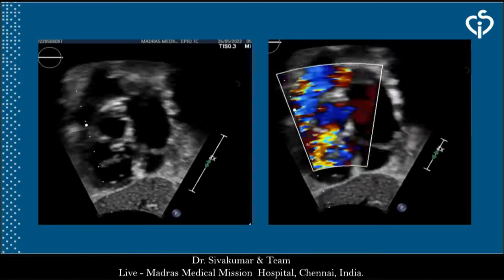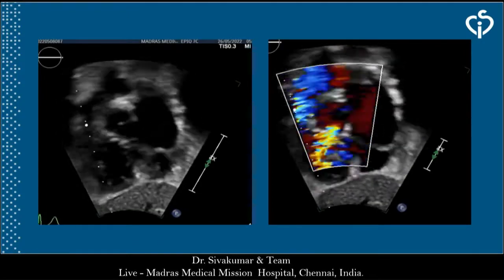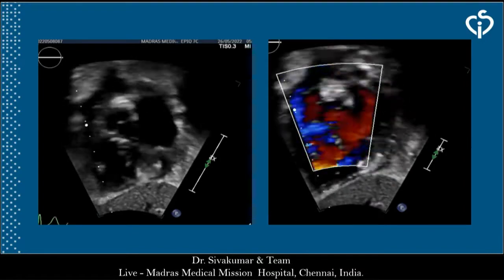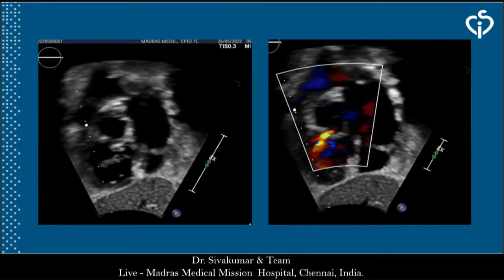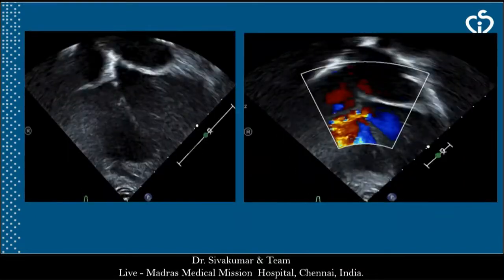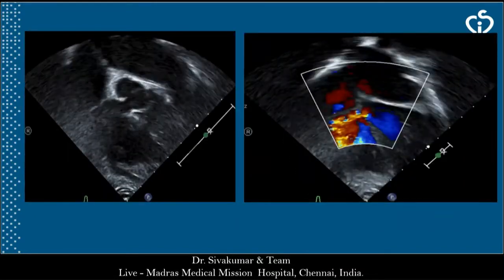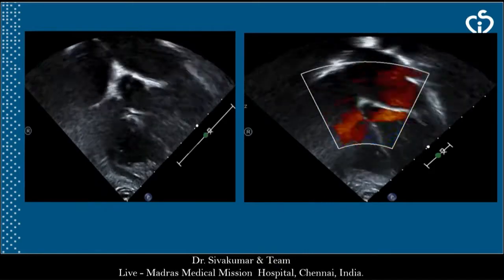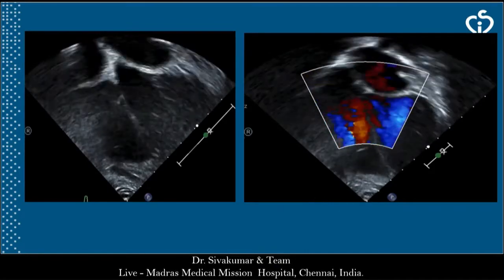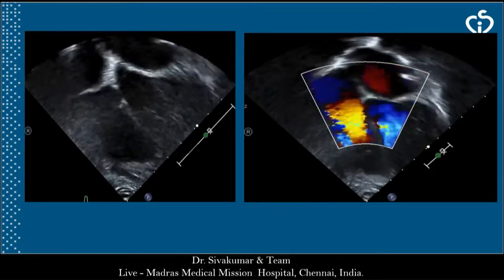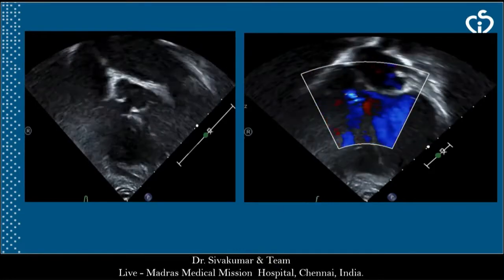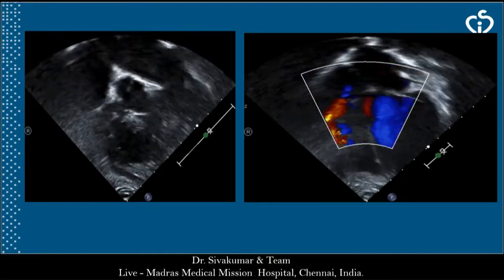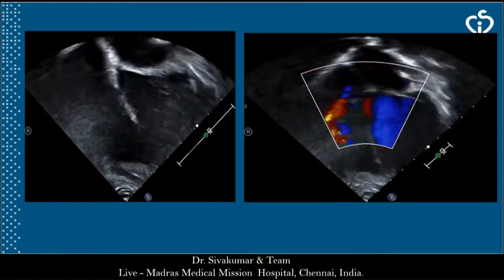This is her echo — the subcostal view which shows the perimembranous VSD. This is the apical 5-chamber view in which we can see the perimembranous VSD shunting left to right.